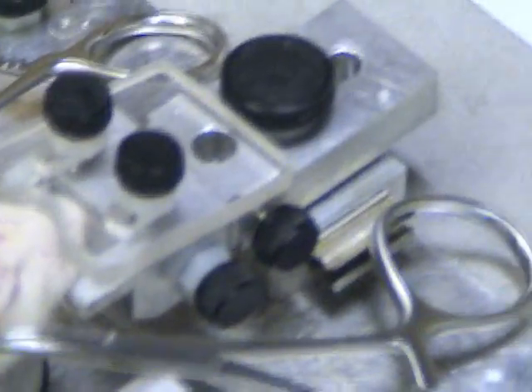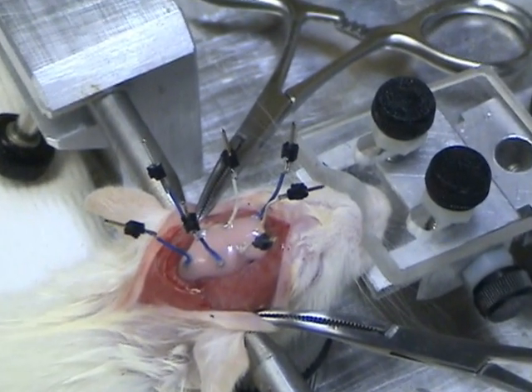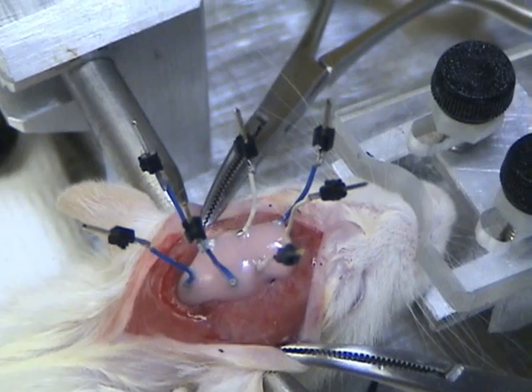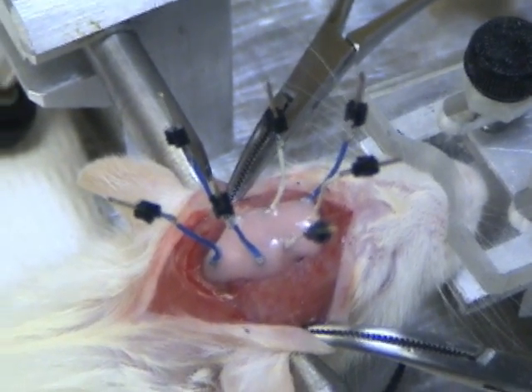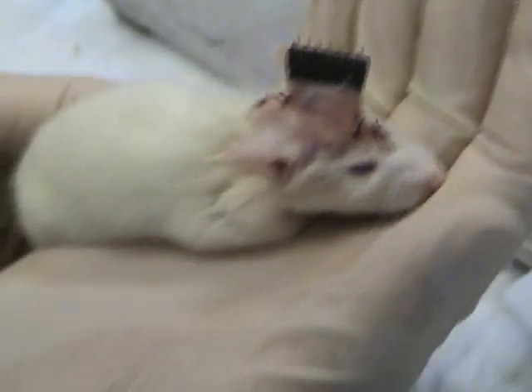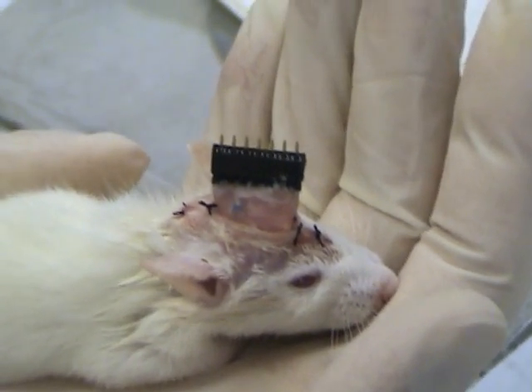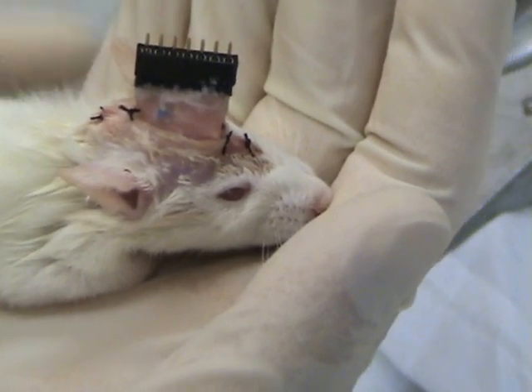Wait 10 minutes to dry up. And then you're going to suture back the skin? Yeah, sure. After removing all the hair, I give it time. They're still sleeping? Sure. So they don't try to scratch it off. How long are they going to be sleeping after the surgery? Maybe 2 hours — that depends on the depth of the anesthetics, the ketamine.